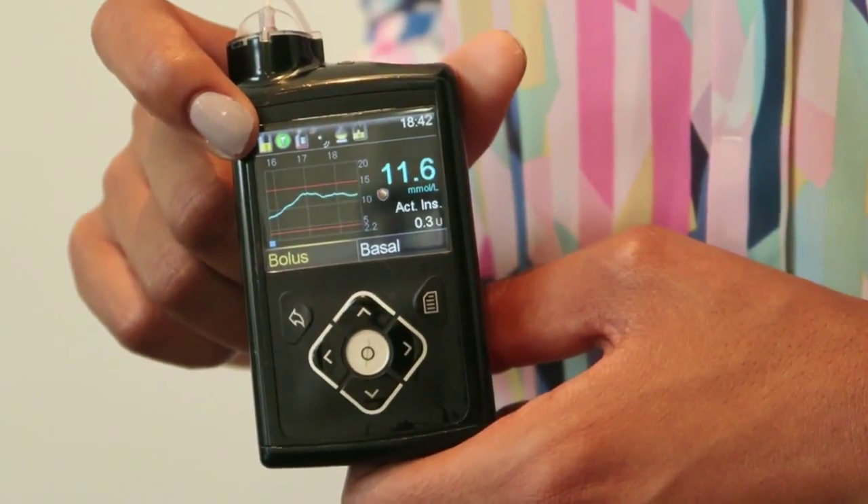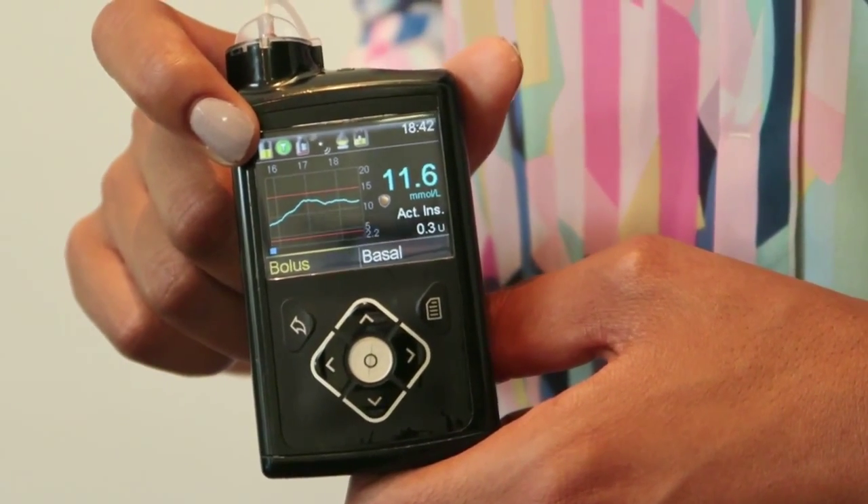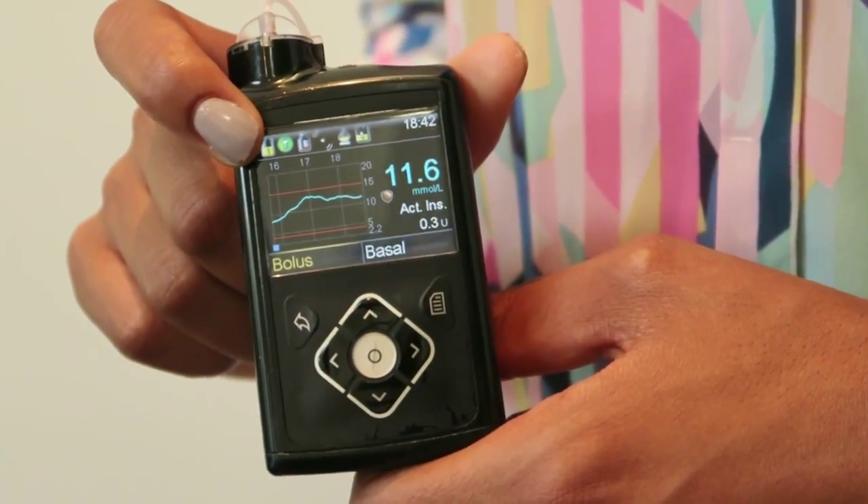Hi, so I'd like to tell you a little bit more about the Medtronic Mini Med 640G. We're going to have a really brief look at the home screen and also the main menu options.